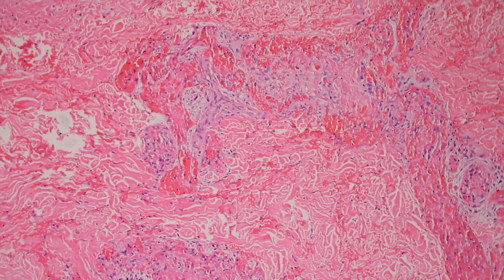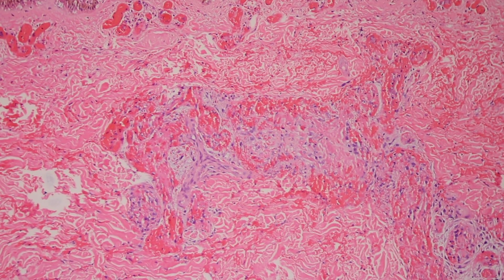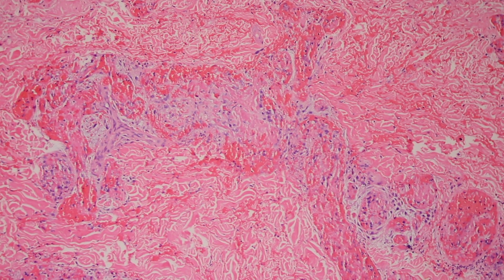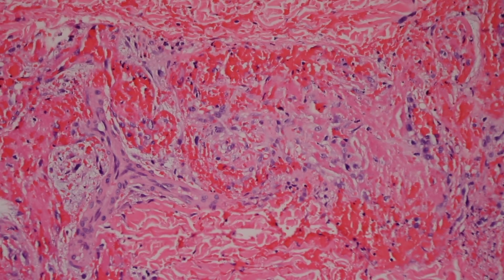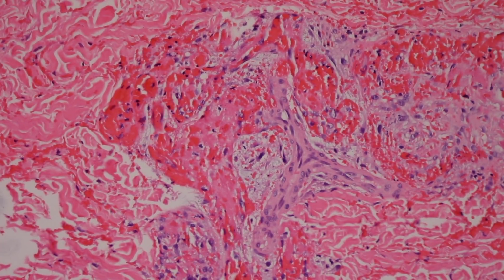And this is also causing all the vessels to be damaged. There's blood leaking out, and there's hemorrhage, all sorts of red blood cells out in the dermis, and a bunch of fibrin thrombi filling these vessels and blocking blood flow. And if you look also, it's a little more subtle in this than in the previous cases, but these are not just fibrin thrombi like we'd see in any normal coagulopathy or clotting disorder.